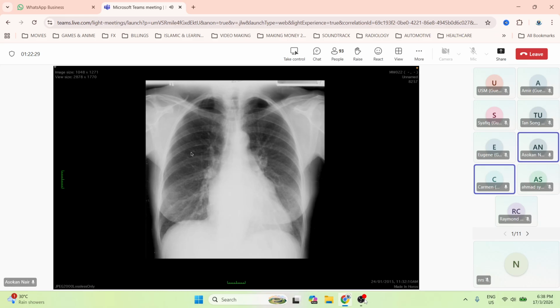All right. So in the exam, sometimes you may be given a big heart, not so common, and it is either due to valvular heart disease, which you may be able to pick up, or due to pericardial effusion. Pulmonary arterial hypertension seldom presents with gross cardiomegaly, because in that case you usually get a right heart enlargement, not left heart enlargement.